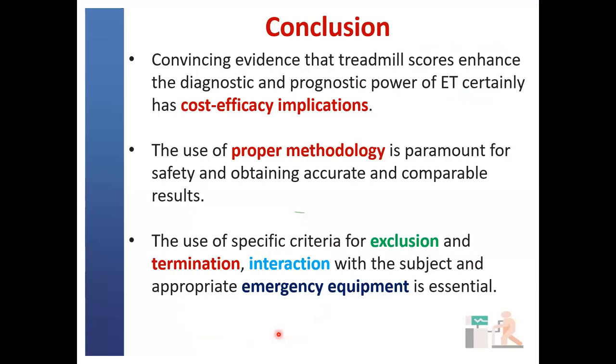So in conclusion, there's convincing evidence that treadmill scores enhance the diagnostic and prognostic power of exercise treadmill stress tests, and this certainly has cost and efficacy implications, particularly when you compare it with how much it costs to have an angiography. And if the proper methodology is adopted, it is actually very important for safety and also helps us to obtain accurate and comparable results.